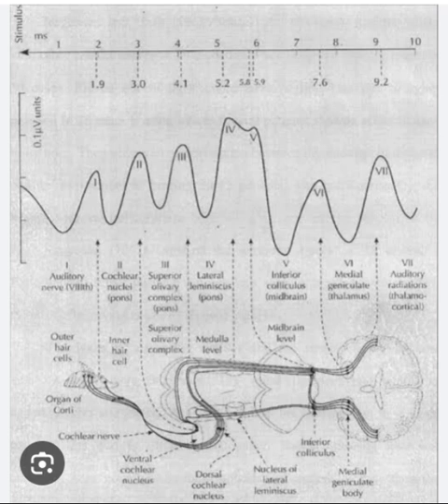the integrity and functionality of the auditory pathways, particularly in individuals who cannot reliably communicate their auditory experiences. This non-invasive test assists in diagnosing various hearing disorders, such as sensorineural hearing loss, auditory neuropathy, and brainstem lesions, by pinpointing the location and nature of the impairment along the auditory pathway.